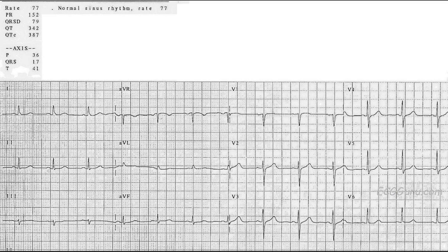Speaking of P waves, there should be a P in front of every QRS, even if they're a little hard to see, like in lead three. We know lead three has a P wave because lead two and lead one do. There should be a P wave in front of every QRS, and there is in this case.